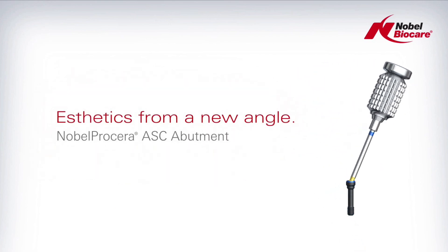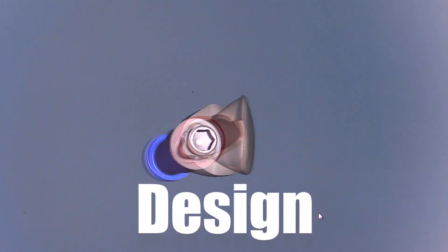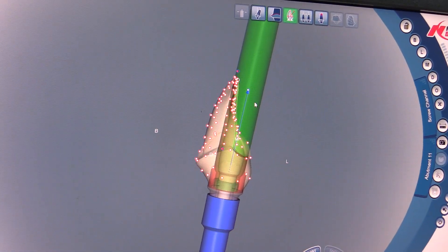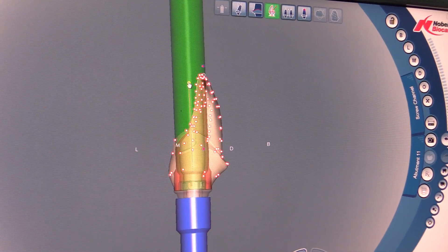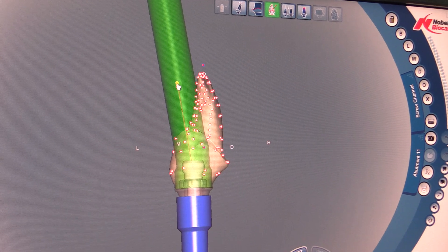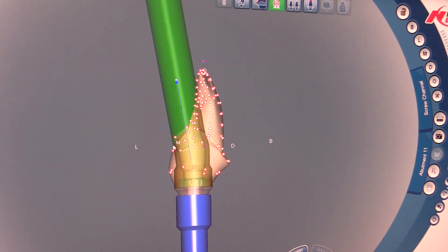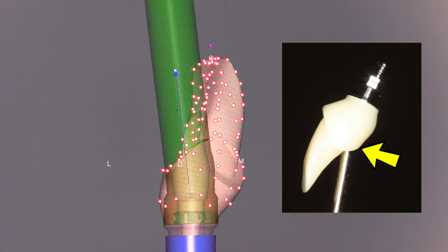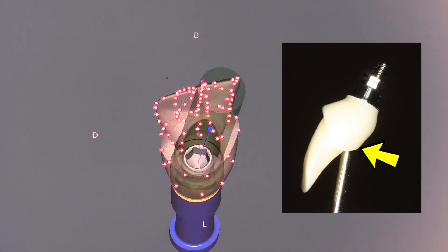Looking at this abutment design more closely, we'll see the minimum thickness of the core of the implant abutment, which is the channel. When we turn the channel technology on and start to pull it back, you can see that this minimum core is actually turning at the same time, enabling you to keep the strength needed in this abutment. We like to keep this lingual area in zirconia — not adding porcelain here — to maintain the strength as we're tightening down the abutment.